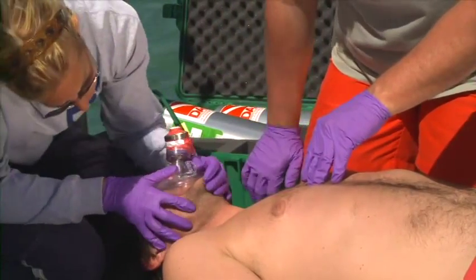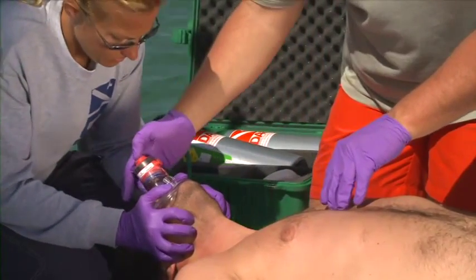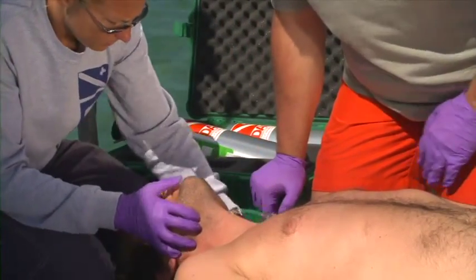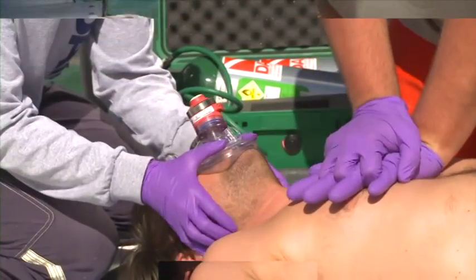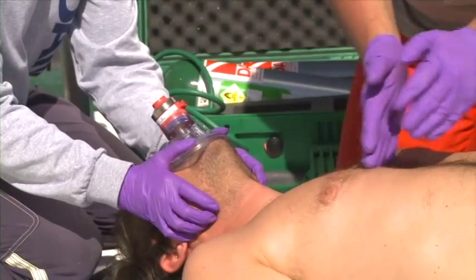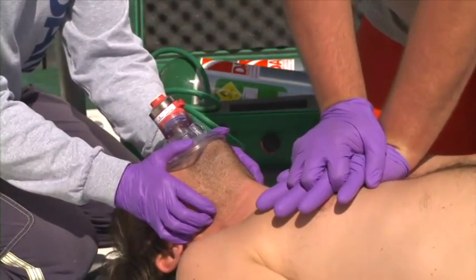If the chest does not rise, reposition the airway. Ensure a good seal on the mask and attempt another ventilation. If the chest still doesn't rise, check for airway obstruction. Ensure the airway is open and allow the diver to exhale fully. This minimizes the risk of both lung overpressurization and gas delivery to the stomach, which can cause vomiting.